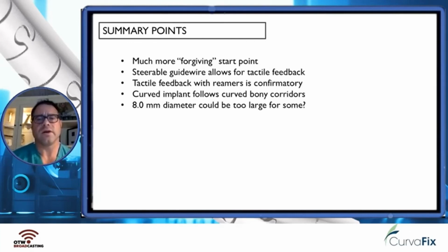The steerable guide wire does allow for some tactile feedback. I think it's nice. You can turn it with the T-handle and feel it scratching, quote unquote, along within the osseous pathway, as one of my scrub techs is very fond of saying. The tactile feedback rather is also very, I think, interesting because when reaming, it's almost like you're reaming a long bone. You can feel the chatter, quote unquote. And this to me was an interesting experience.